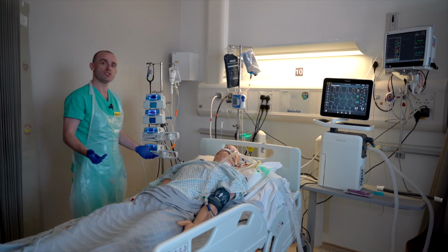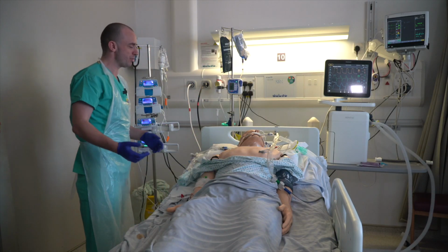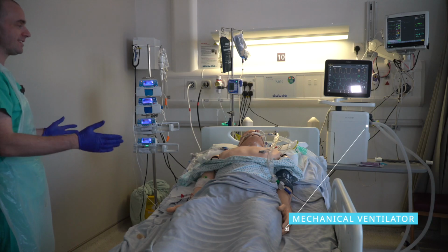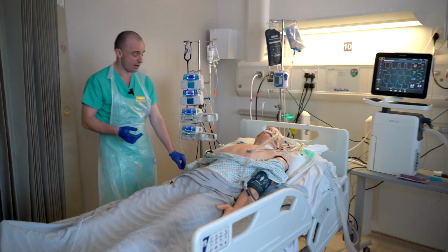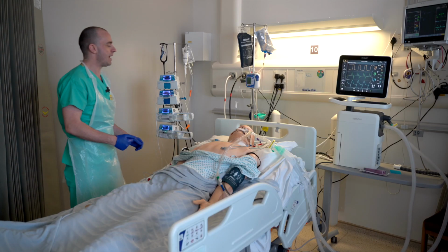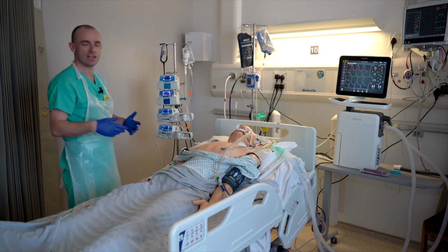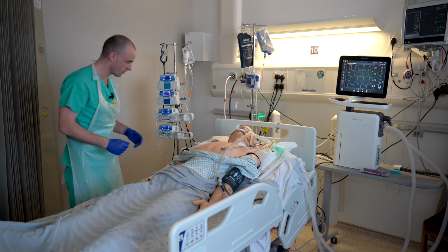So, I'm going to move on to the rest of the respiratory assessment, and this is going to follow a look, listen, feel type of approach. It's important to look and stand back at the patient. So I can see this patient is on a ventilator. I need to look at the chest and see whether or not there is symmetrical chest rise. I'm going to look and see if there are any drains, and here we have a chest drain, and look and see whether or not it's in the right place, whether it's swinging, and also look and see if there's any asymmetry or any injury which might suggest something like a rib fracture or similar. But in the majority of cases, we won't anticipate anything like that.